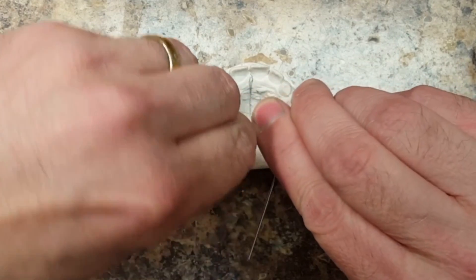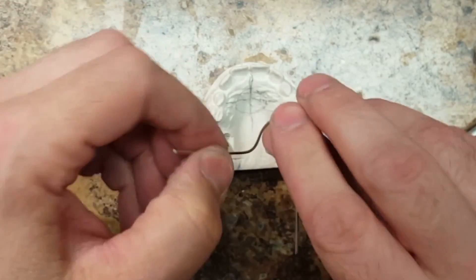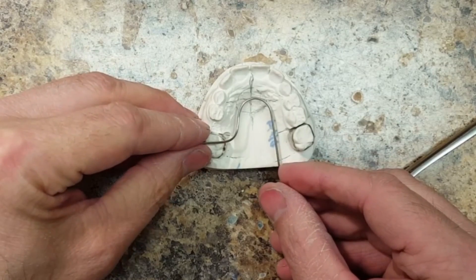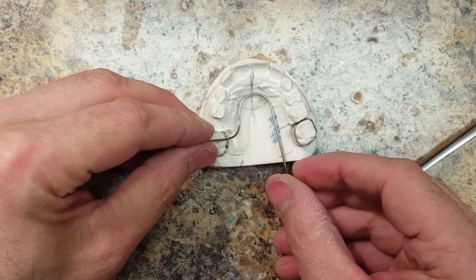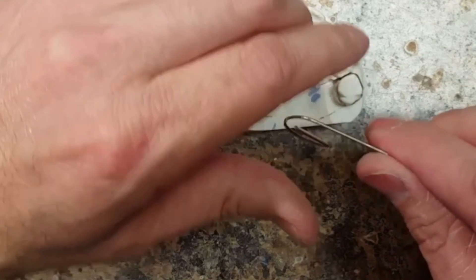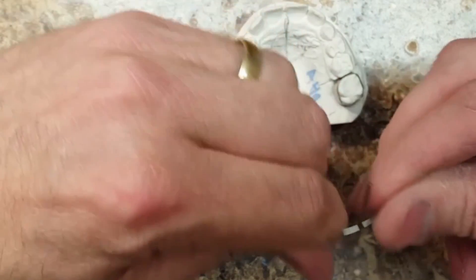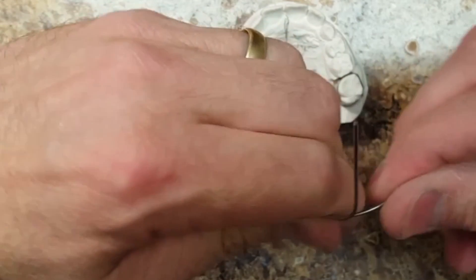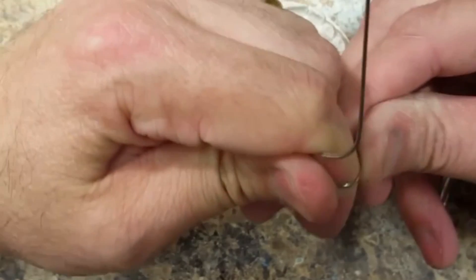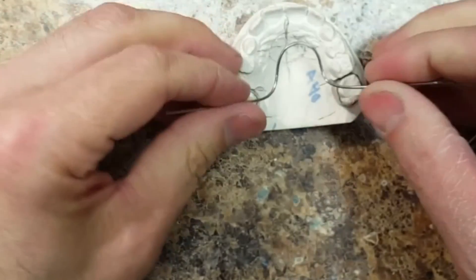The next step is a little tricky. I'm going to bend the wire upward and then outward. I'm going to demonstrate this in slow motion so you can have a better idea of what I'm talking about. This takes practice — you're not going to get it right the first time, especially if you're trying this appliance for the first time.